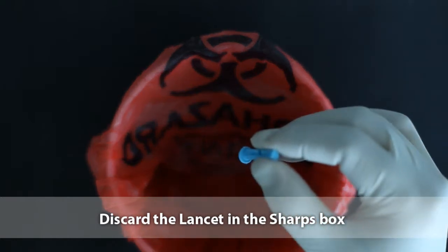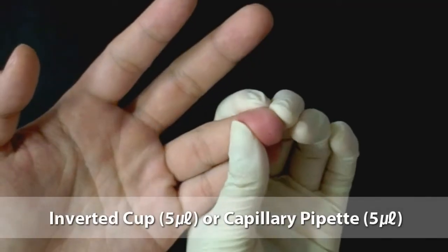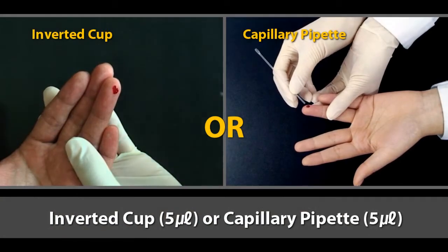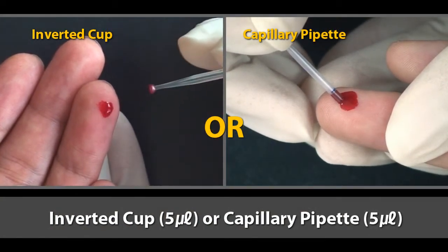Discard the lancet immediately after pricking the finger. As the blood bubbles up, take a disposable specimen collector and dip the circular end of an inverted cup into the blood specimen.